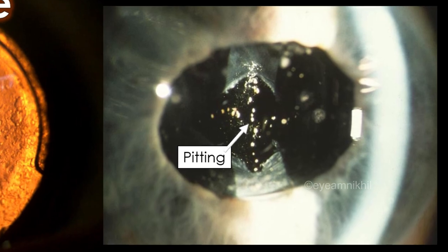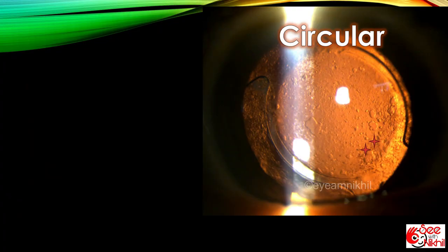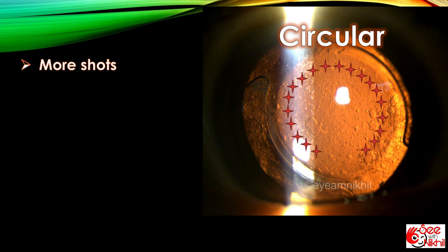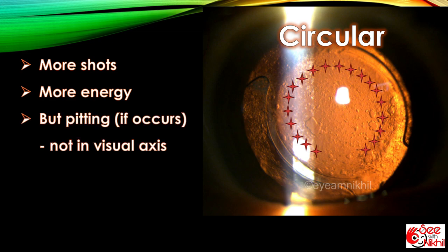In a circular pattern, a circular opening is created by firing shots adjacent to each other in a circular manner. This requires more number of shots, therefore greater amount of energy. But the advantage is that even if pitting occurs, it won't be in the visual axis.